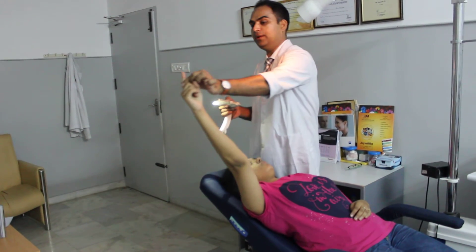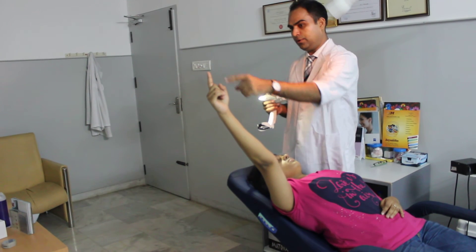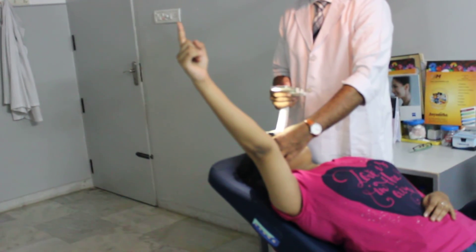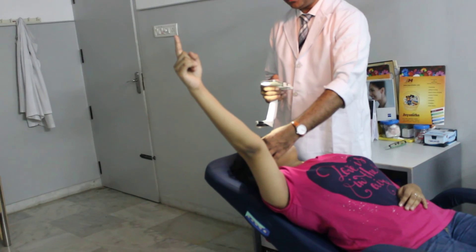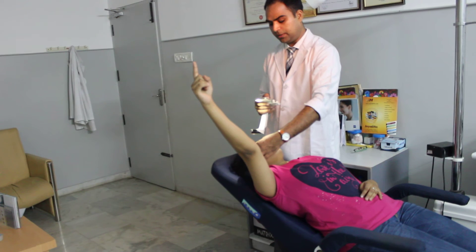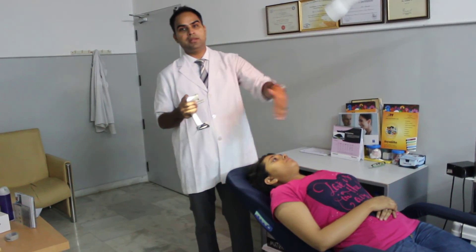Go close to the eye — you should be on the right opposite side — and ask the patient to look at your finger as a target. Again go close to the eye, see the red reflex, keep coming up till the entire screen fills with the 20-diopter lens view, and pause a little so that auto-focus works and the image becomes clear, then hit the scan button.